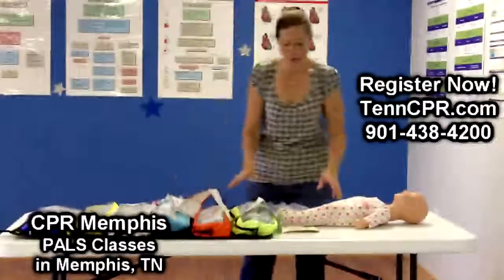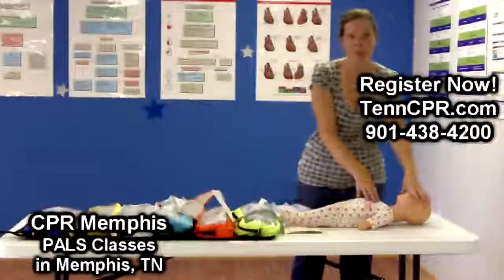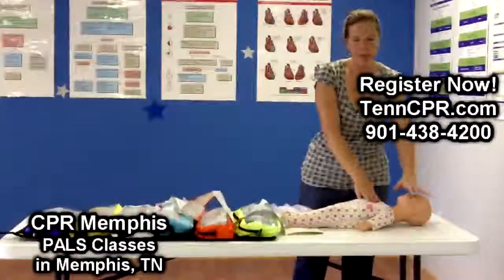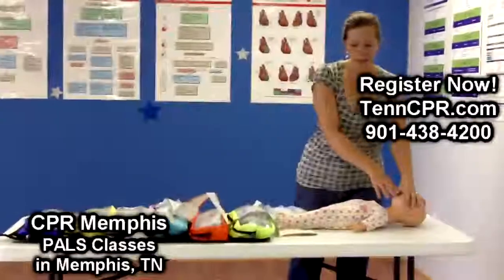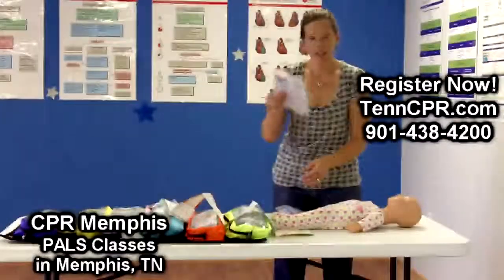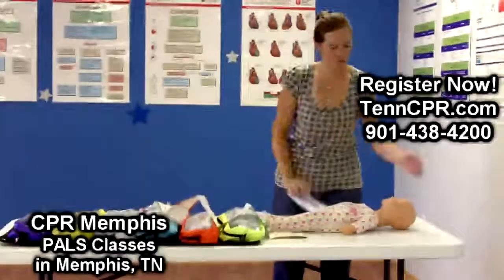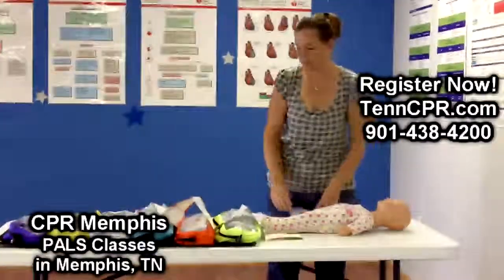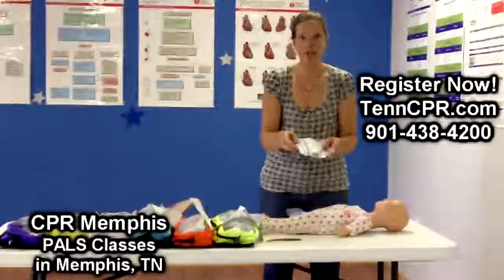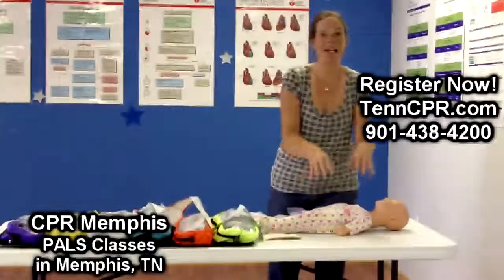Now we have a team of people, because it's PALS, where one person is performing CPR, we have another person managing the airway adjuncts. We still have nurses that can successfully pull up the IO, the proper size equipment to drop in an ET tube, and another one starting an IV — and we can just keep the algorithm flowing nicely. Again, stress free.